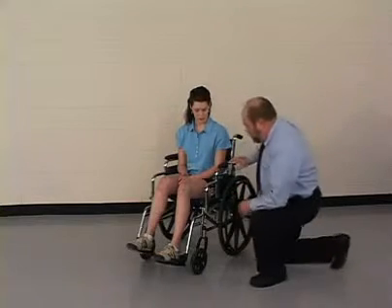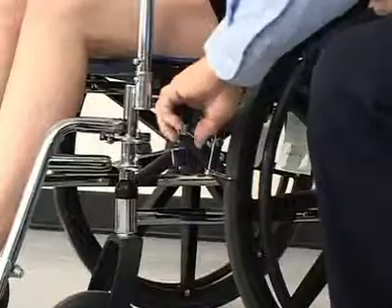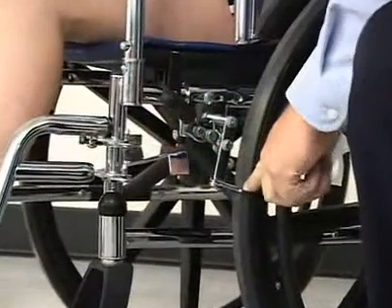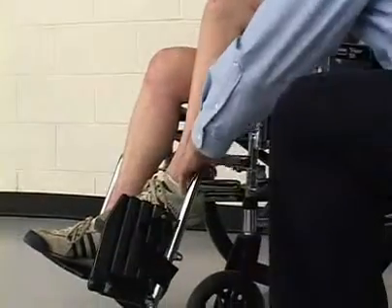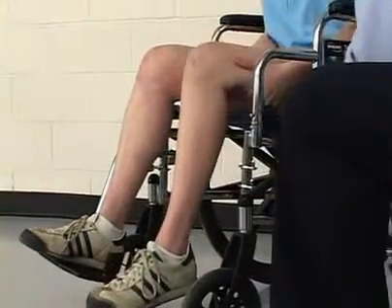When a patient is assuming standing from or assuming sitting in a wheelchair, the chair should first be stabilized. Make sure that the wheel locks are engaged and the wheelchair is placed against a stable surface, if possible. Foot plates should be raised and the footrests removed and placed out of the way of the therapist and the patient.